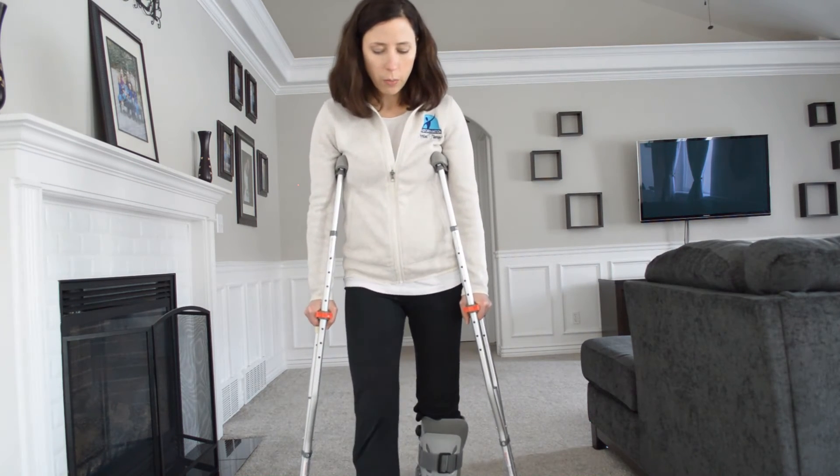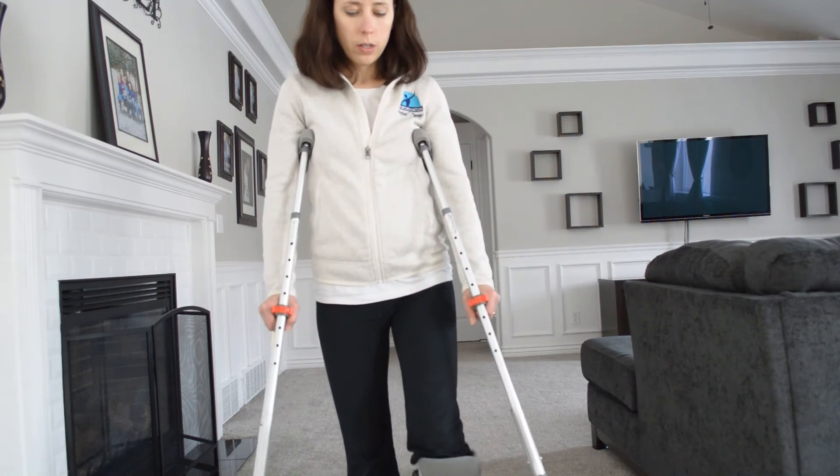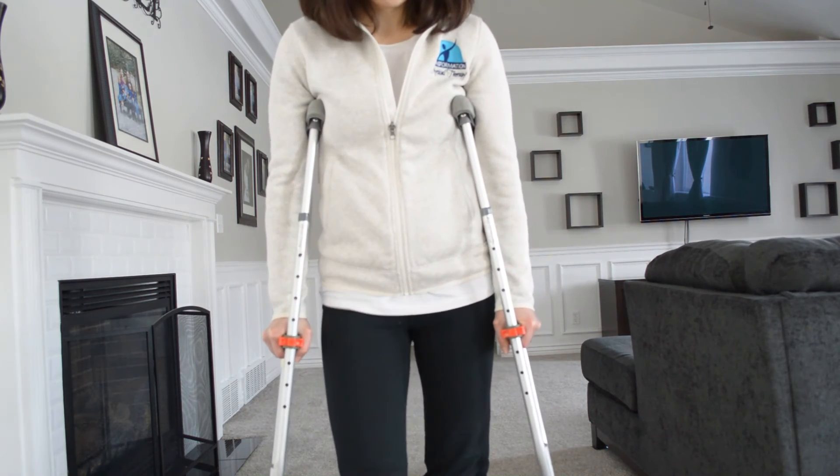So you're going to step through and then bring that foot through. Step through, bring that foot through.